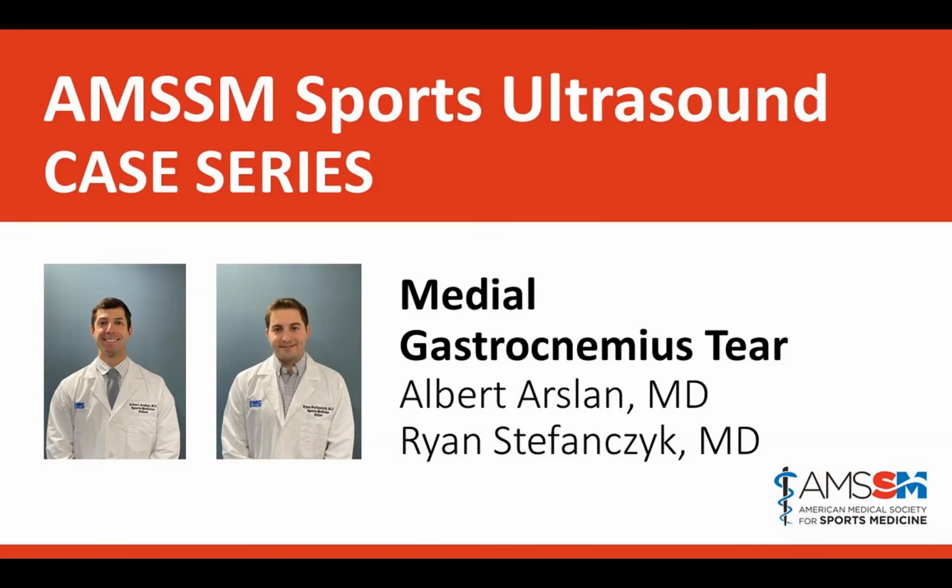Yeah, kind of the same thing. I think if you catch these in the first week, it's probably fairly simple fluid or simple blood product that you can pull out pretty easily. If I can't even get mild compression of that fluid with the transducer, then I'm a little hesitant. And I also will go in like you, Brennan, and try and lavage these things.